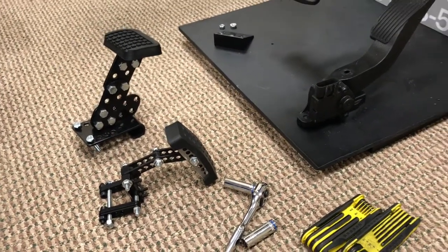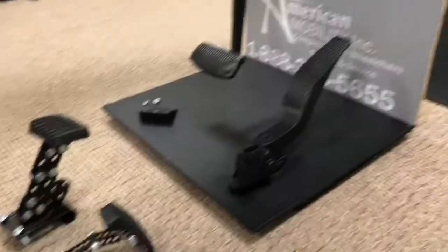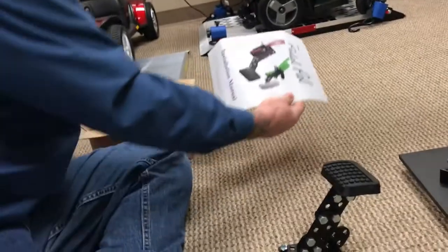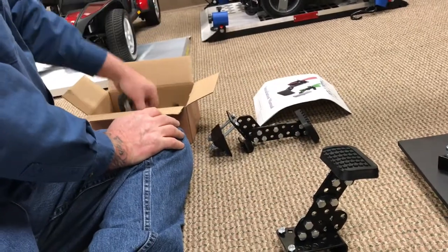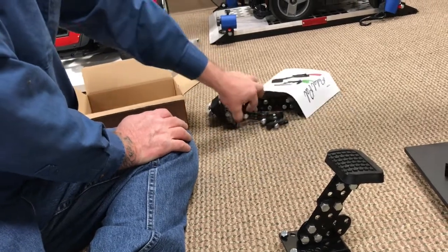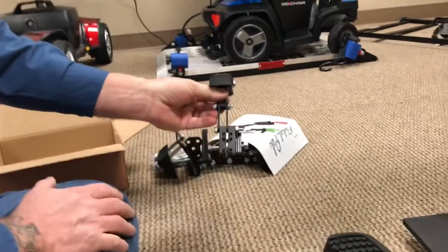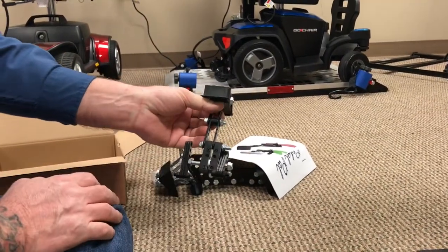I'm going to give you a quick installation shot at these pedal extenders — they're real easy to do. When you get them in the box you're going to get the installation manual, your brake extender, your gas extender, and a little bit of hardware. This is what it looks like coming in the box. They made it so that you can configure it to any gas pedal.